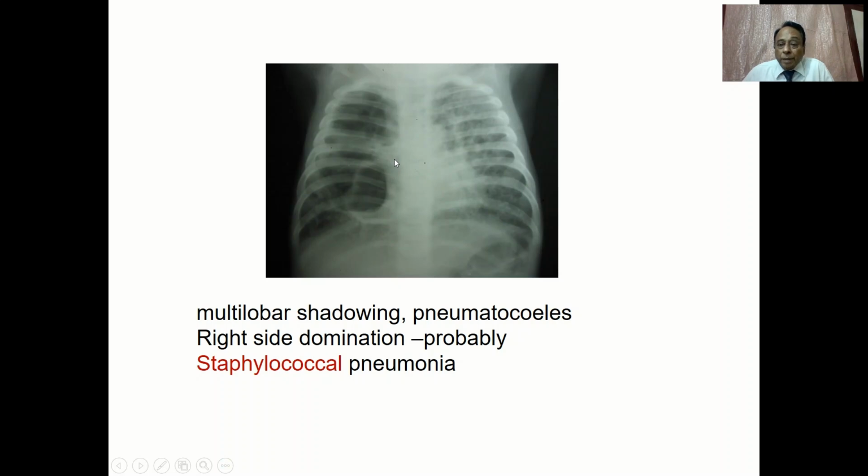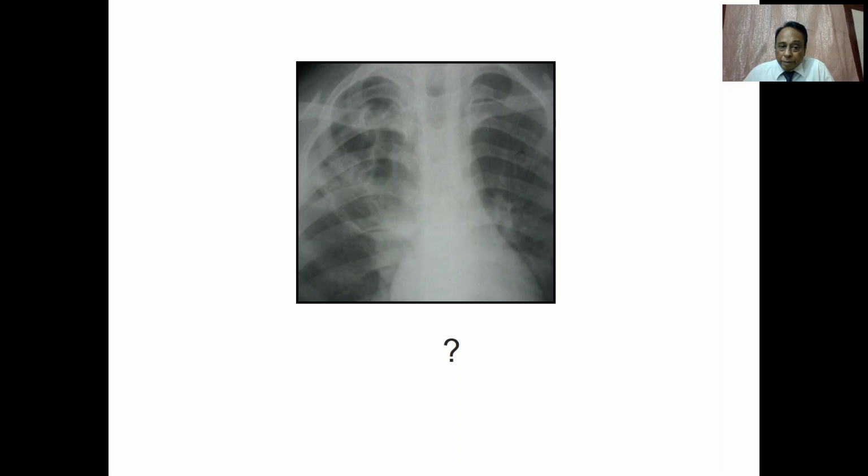All these things, and that too if the child is presenting with a small furuncle and the pneumonia happens 3 to 4 days later, and such a clinical history is there, you can say that the child is suffering from staphylococcal pneumonia, and accordingly you can choose the antibiotics.